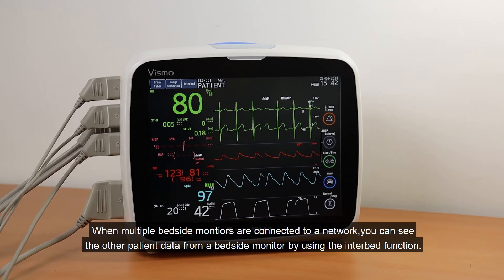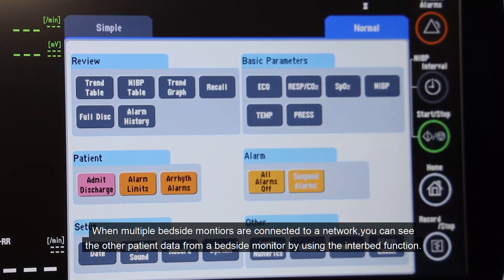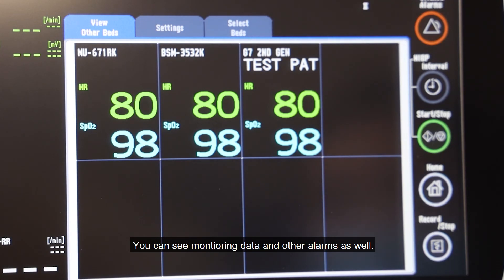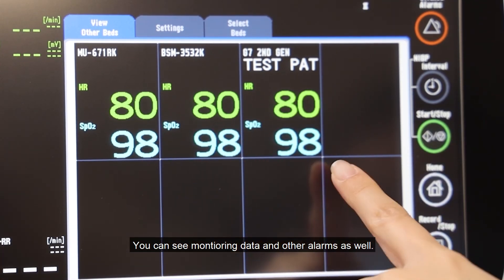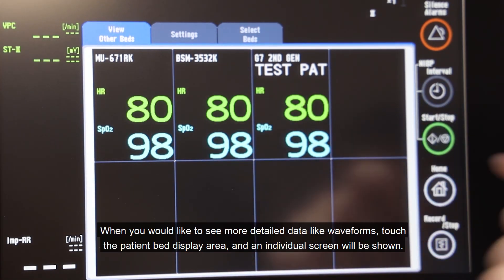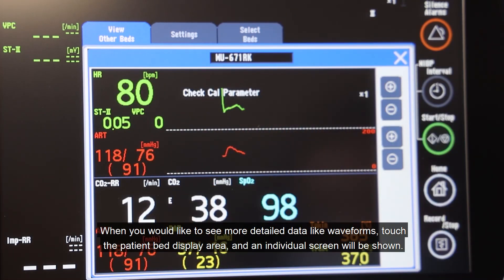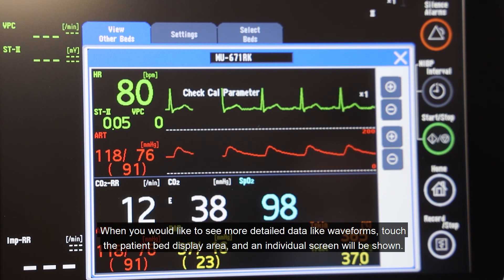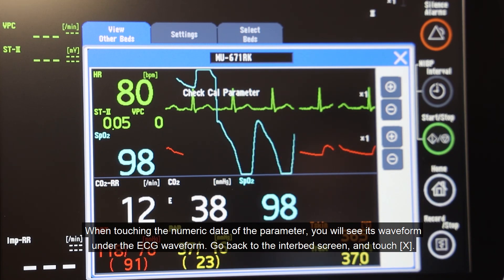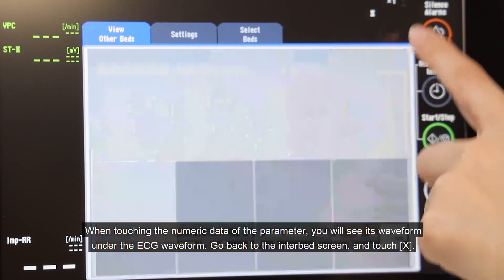When multiple bedside monitors are connected to a network, you can see other patient data from a bedside monitor by using the Interbed function. You can see monitoring data and other alarms as well. Up to eight other patients' data can be shown on the screen. When you would like to see more detailed data like waveforms, touch the patient bed display area and an individual screen will be shown. When touching the numeric data of a parameter, you will see its waveform under the ECG waveform. Go back to the Interbed screen and touch X.